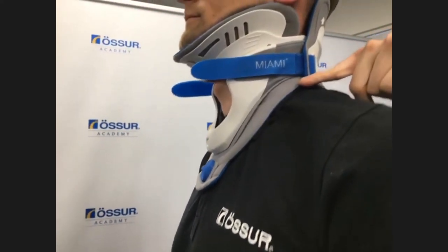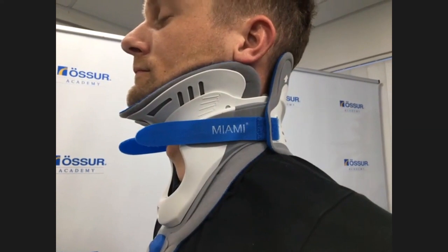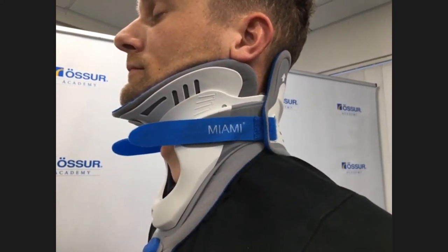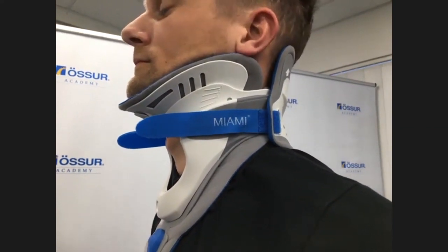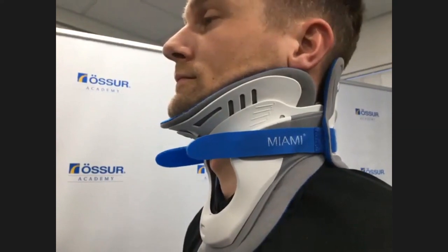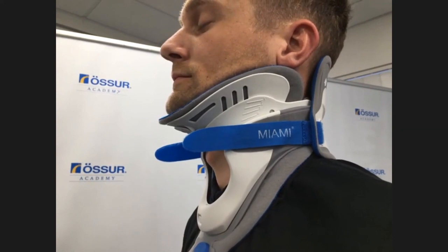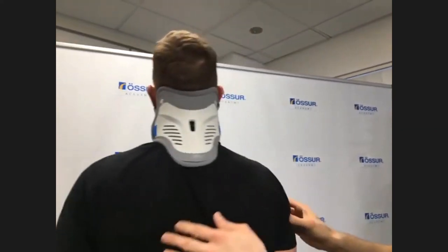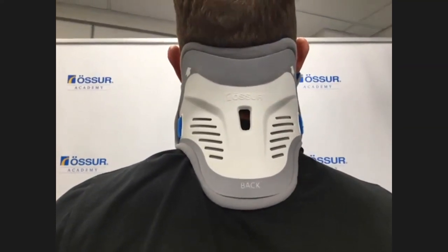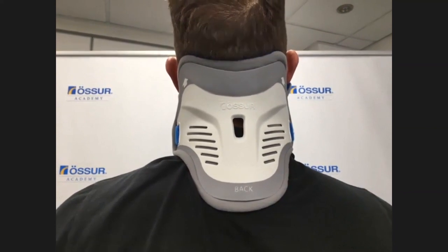Looking a little bit higher up, you can see that the sides of the collar are coming up and over the shoulders, making sure that we're not putting any contact on the trapezius muscle. And then looking at the jawline, you can see that we're recruiting all of the lateral jawline to make sure that we're spreading the pressure around the whole of that section. We get Pete to turn around. You can see that it's cradling the back of the head, positioned nice and centrally, and making sure that we've got good anatomical shaping either side.